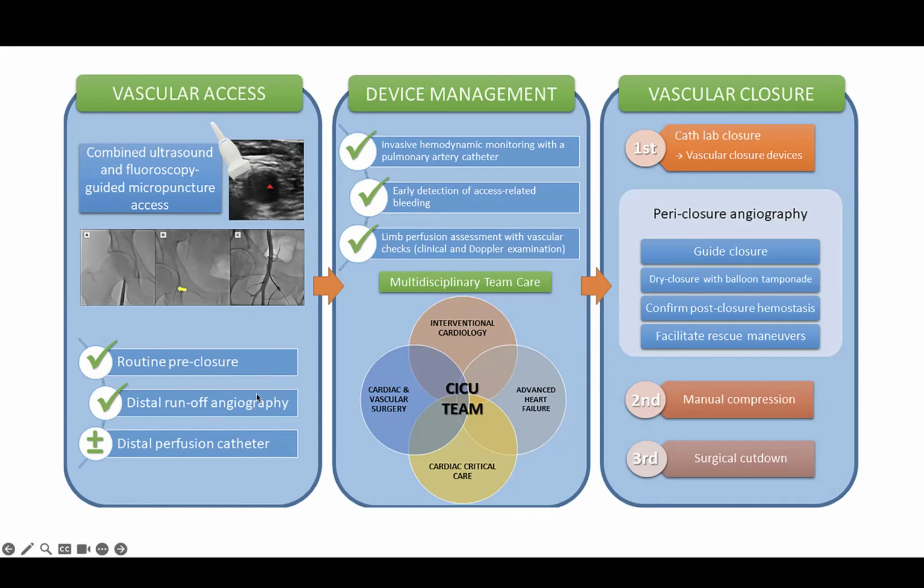So DPC, there's a lot of actually pretty neat research going on, in terms of active bypass or passive bypass. Do you connect this side port to the Impella sheath, or do you get a contralateral access and do fem bypass? So pretty much what they're doing is like FFR. You get a wire distally and then a wire proximally and see what happens when you occlude the vessel with an Impella sheath and how much perfusion you get if you're connected through the Impella sheath or if you get another femoral access as a donor to the ipsilateral side.